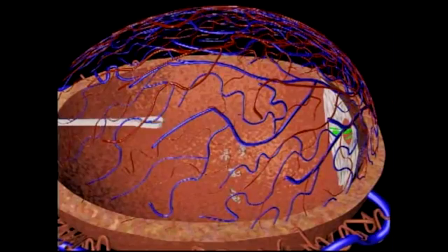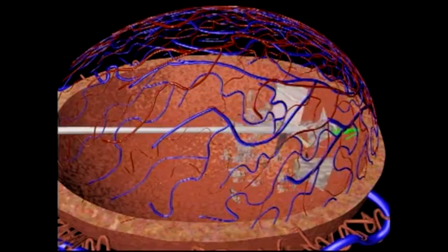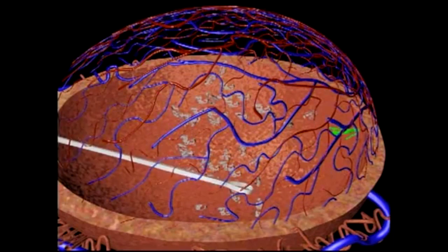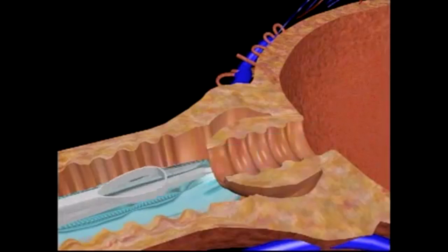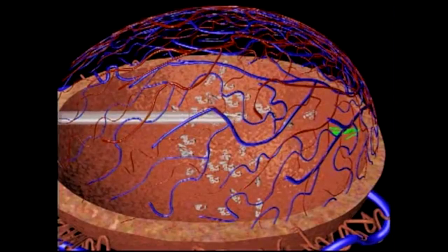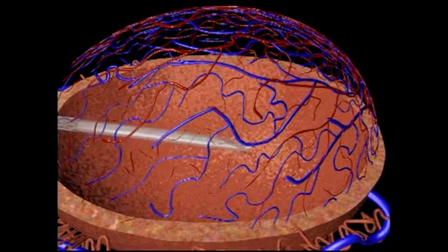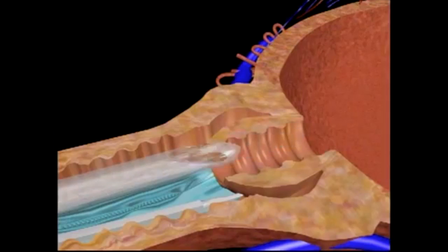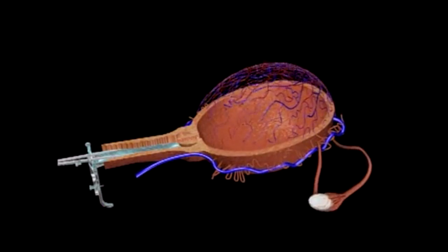After this process has been completed, a curette is scraped along the inside wall of the uterus to dislodge any remaining tissue or placental matter. Then, the suction cannula is again used to remove whatever tissue was dislodged by the curette. When the uterus is empty, the tenaculum is released, the speculum is removed, and the procedure is complete.